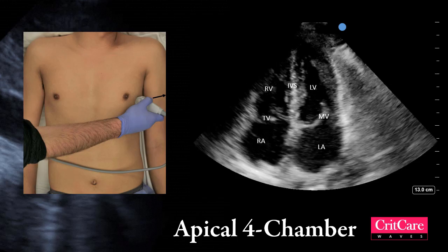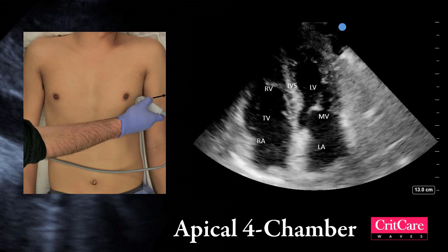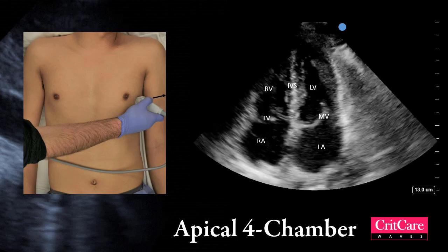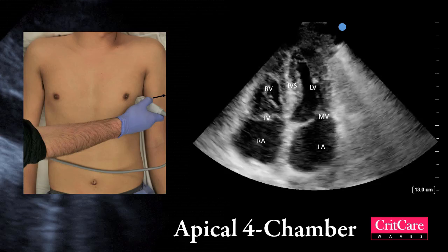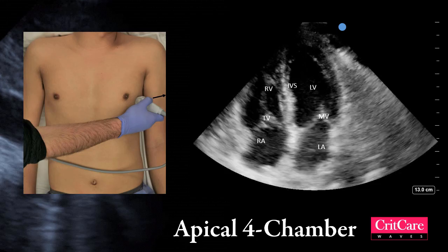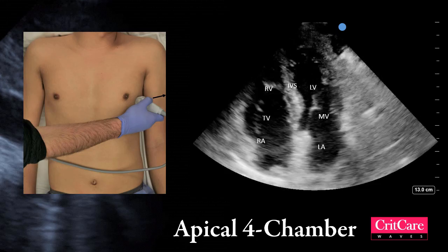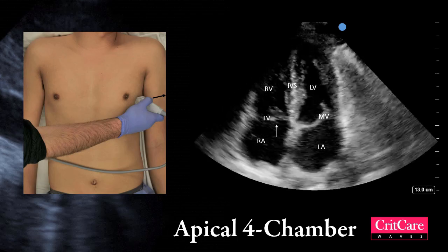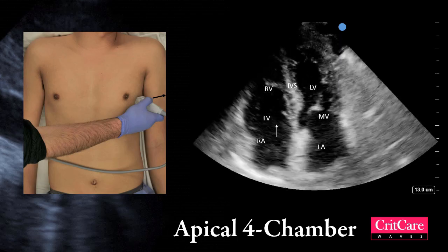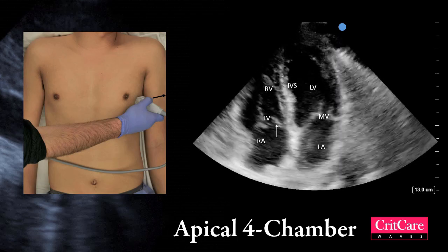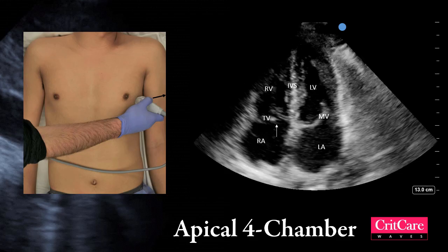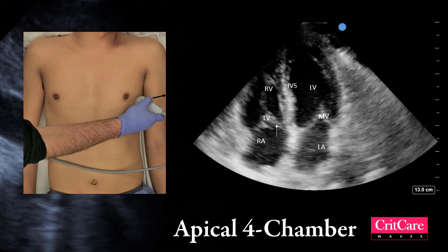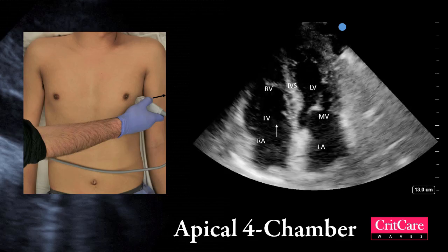The apical 4-chamber view can look identical if the orientation marker is pointing towards the right or 9 o'clock position instead of the left. For this reason, it is important to note that the tricuspid valve is slightly apically displaced compared to the mitral valve. Knowing this anatomic pearl will help you distinguish the mitral and tricuspid valves.